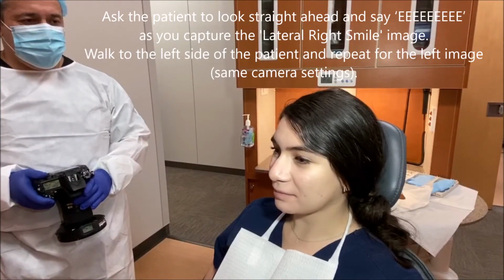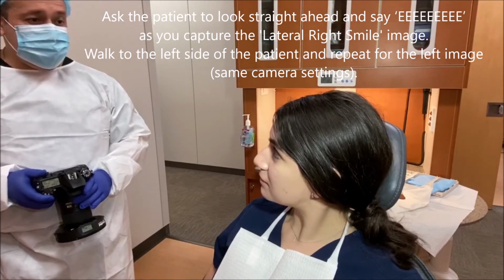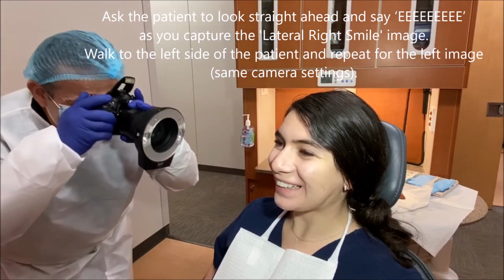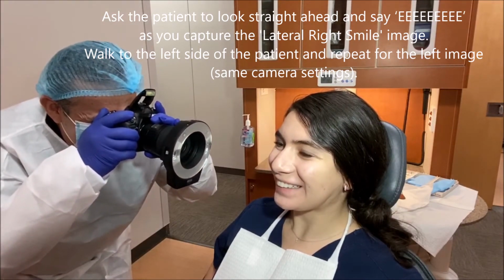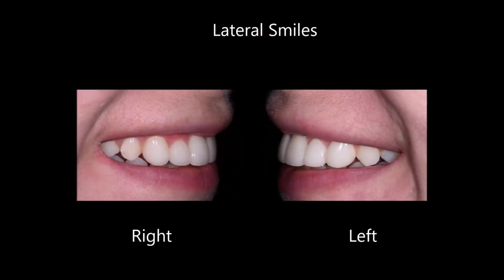Ask the patient to look straight ahead and say "ee" as you capture the lateral right smile image. Walk to the left side of the patient and repeat for the left image. Same camera settings. Lateral smiles, right and left.